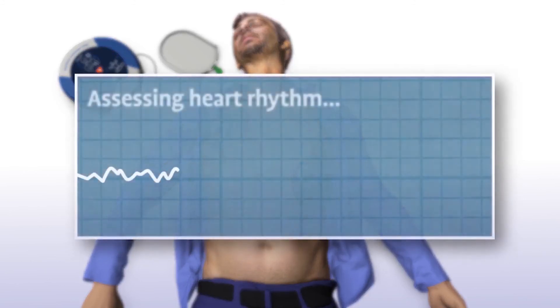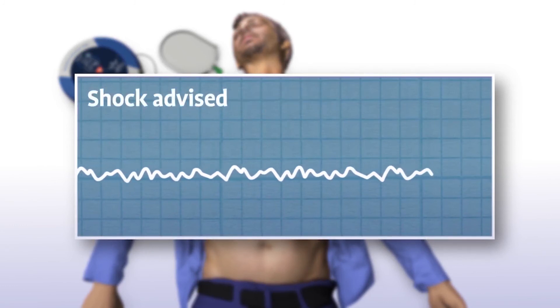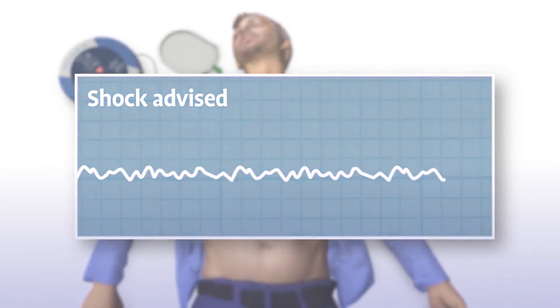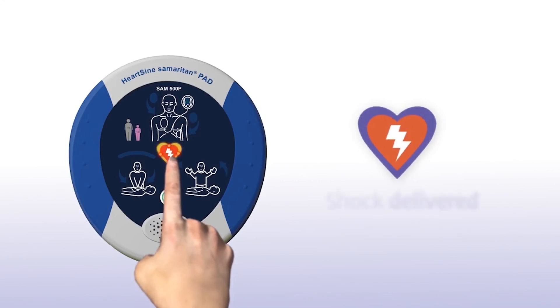The Samaritan PAD automatically assesses the patient's heart rhythm. Do not touch the patient during assessment. It recommends whether or not a shock should be delivered. If shock is advised, stand clear of the patient and press the orange shock button now.